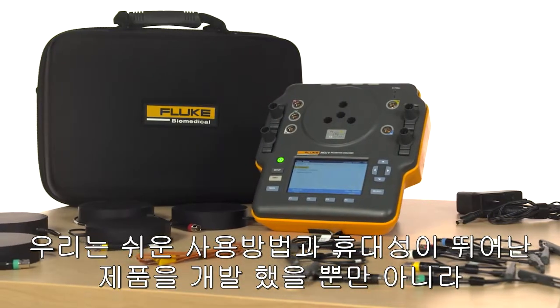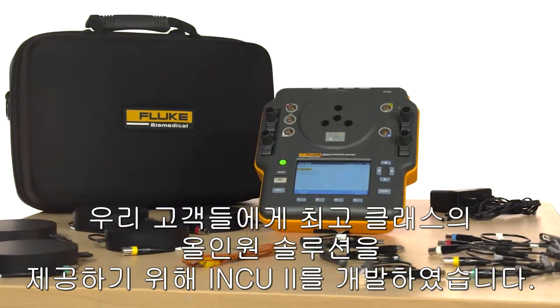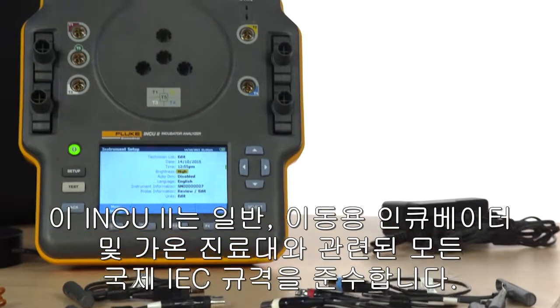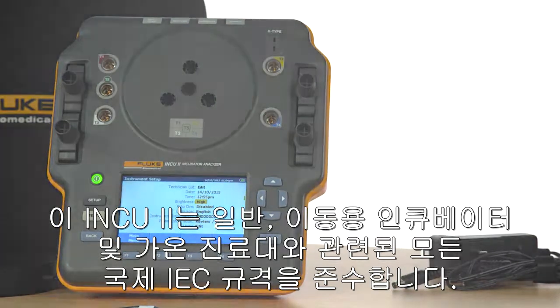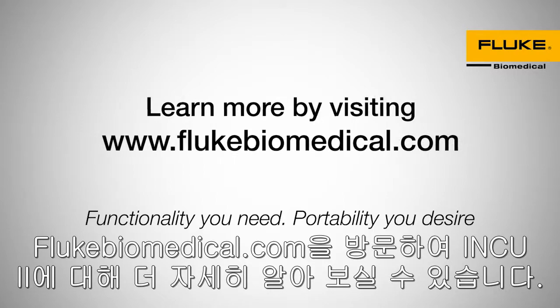We've designed the INCU II to not only be highly portable and easy to use, but give our customers a best-in-class, all-in-one solution. The INCU II is compliant with all global IEC standards for radiant warmers, incubators, and transport incubators. Learn more about the INCU II by visiting flukebiomedical.com.